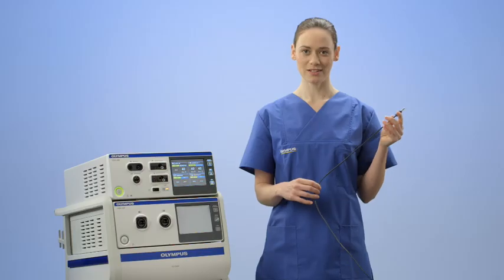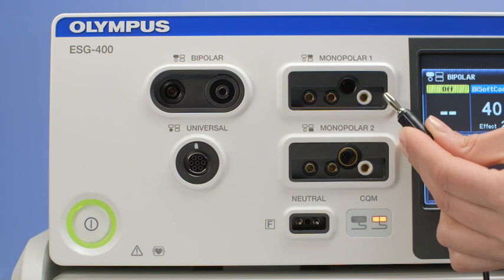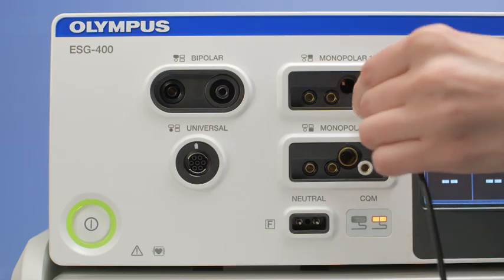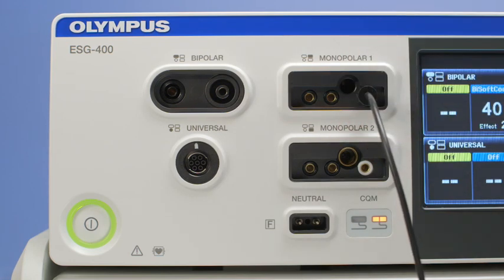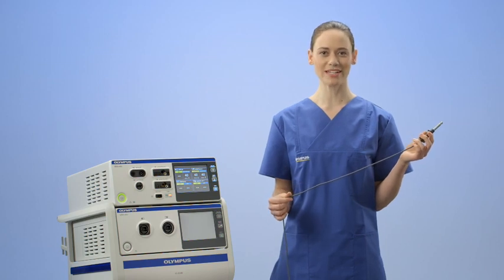A connector often referred to as the four-millimetre banana plug requires some explanation. It is important to connect the four-millimetre banana plug correctly. To do this, use the right socket in the monopolar connection area. A white ring around the socket indicates that this is the right socket for the four-millimetre banana plug. Connecting it to any other socket may cause damage to the generator. Please remember: white is right.